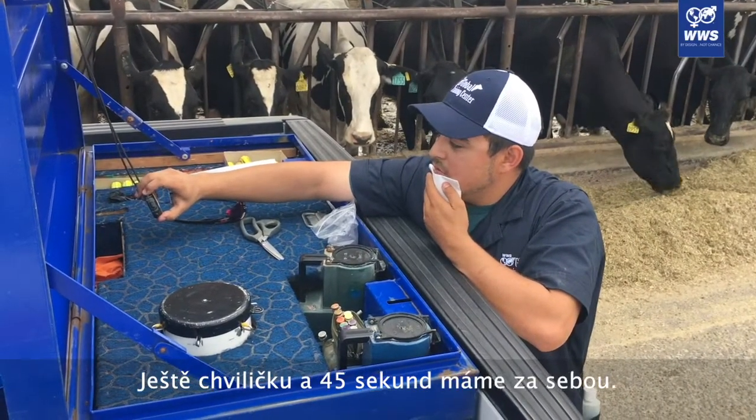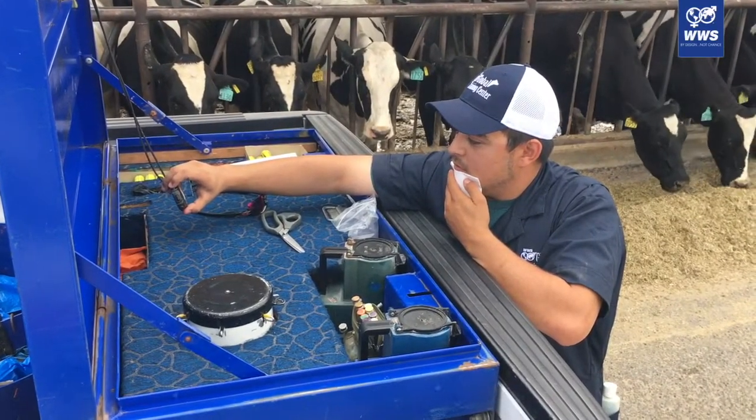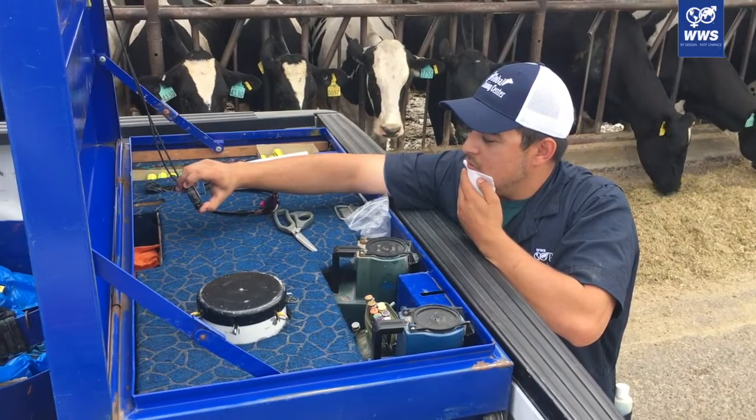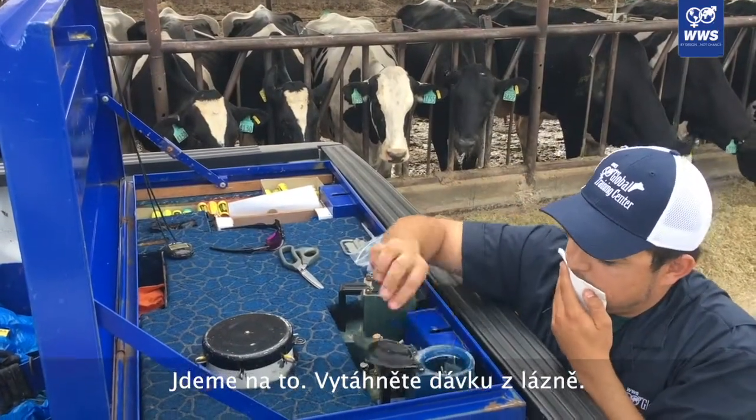Wait a few more seconds until we hit 45. Okay, pull them out.